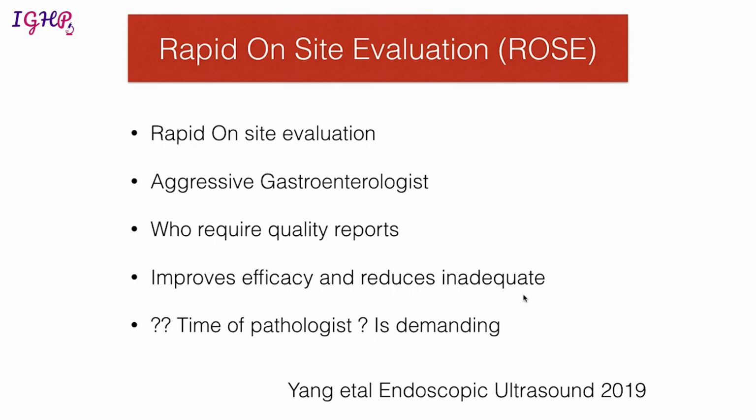So it reduces the inadequate samples which are performed through this endoscopic procedure. Now the important point here is the time of the pathologist, as it is a very demanding procedure and sometimes it can go even up to an hour, and in a very busy lab it will be difficult to do an on-site evaluation because it's relatively demanding. So time of the pathologist is also very important.